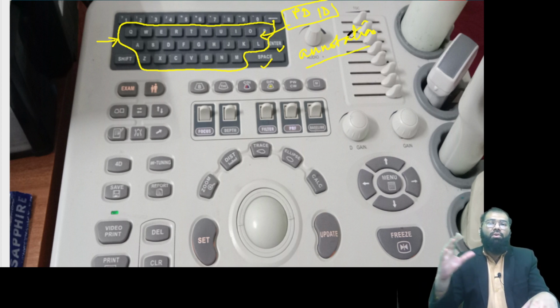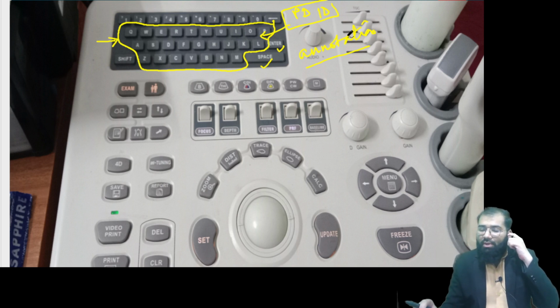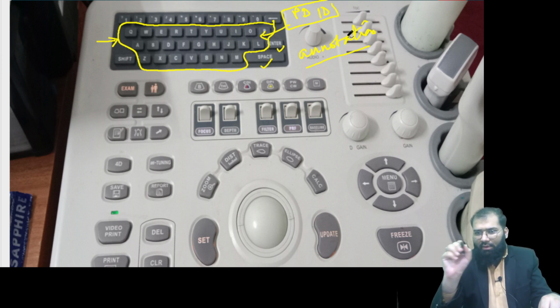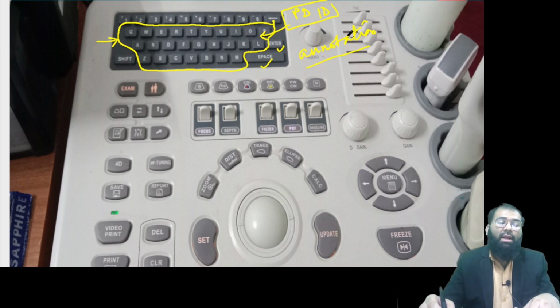Suppose you get a very good case and you want to document it and you want to take images. So in those cases again, you can show an arrow and you can annotate that. That is called annotation. So just like in books we have images shown, there are arrows and the arrows are labeled. So in other words, you can say it's labeling. Okay. So it can also be used for annotation.